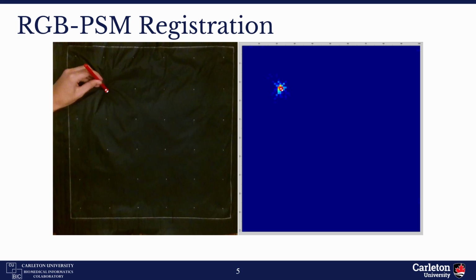To analyze both PSM and video data simultaneously, these data streams need to be spatially aligned through multimodal registration. This type of registration requires manual detection of distinct landmarks within the patient scene. These landmarks must be identifiable in both the video and PSM streams.